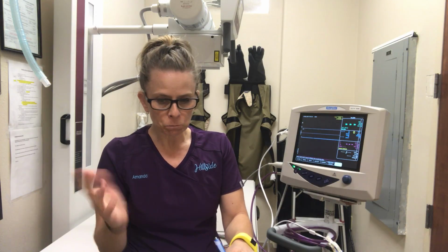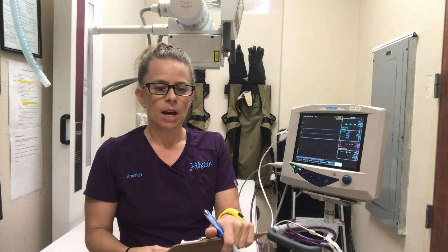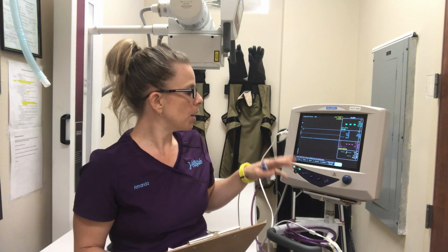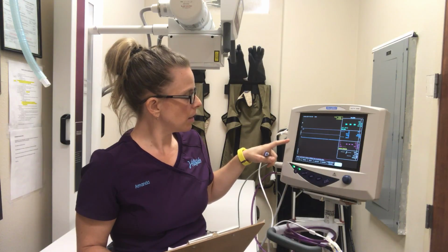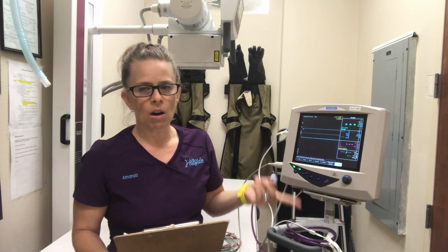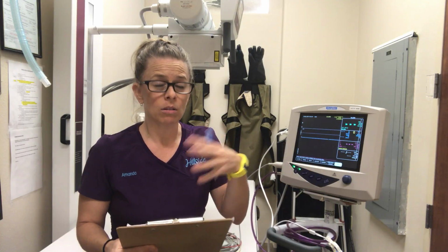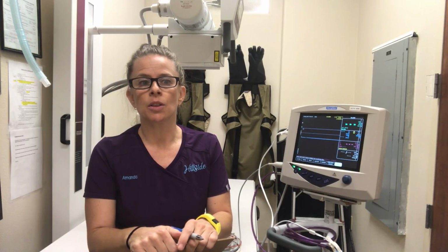So to start, some of the physiological parameters that we monitor: heart rate. A lot of the parameters that we monitor can be used with this SurgiVet. It's a multi-parameter monitor, so it gets a heart rate. We have an ECG, so that will help us with heart rate and heart rhythm, so we can check for any arrhythmias, any other abnormalities.